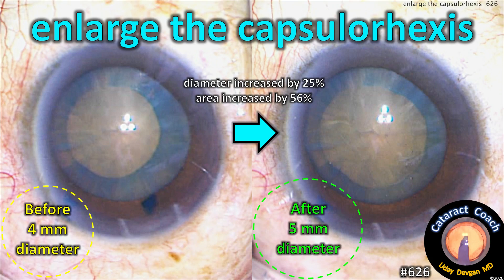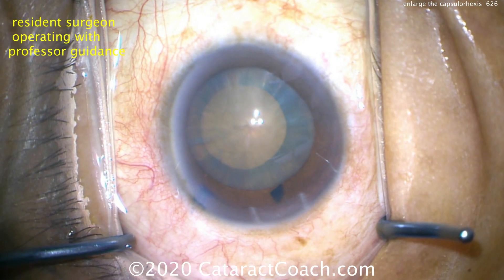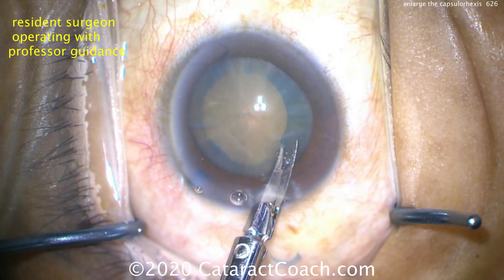Enlarge the capsorhexis. With a dense cataract like this, a 4mm capsorhexis really is a punishment and not ideal. Here's the dense cataract — TriPan Blue Dye has been used. It's a 4mm capsorhexis made by the resident surgeon. That's not going to be ideal. It's hard to remove a dense cataract through that small opening.